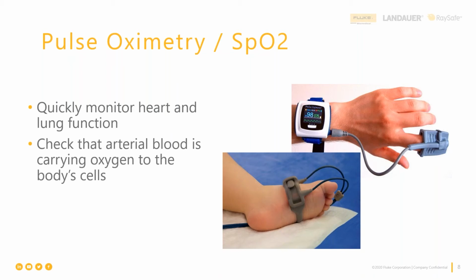The other, more common placement is on the forehead. Think about a technology we'll get into later called reflective SpO2, which is starting to rise as well. Go ahead, Jerry.